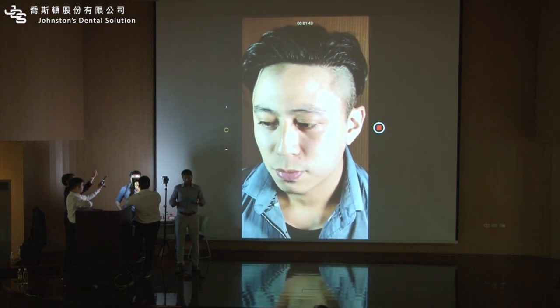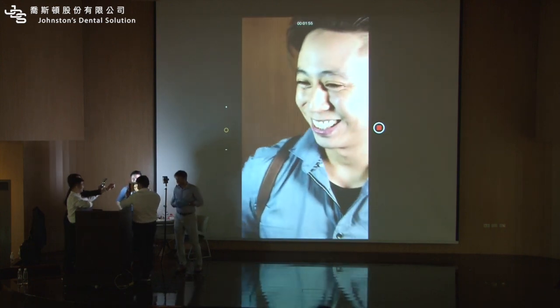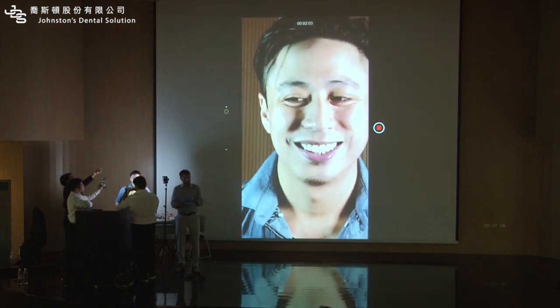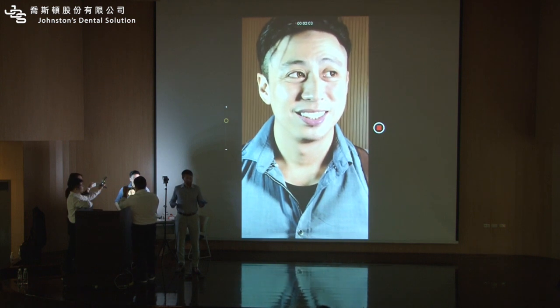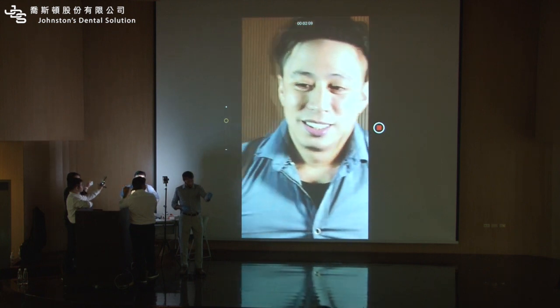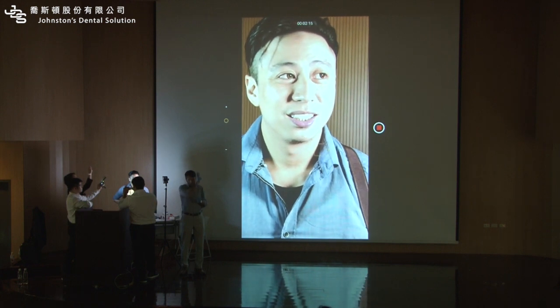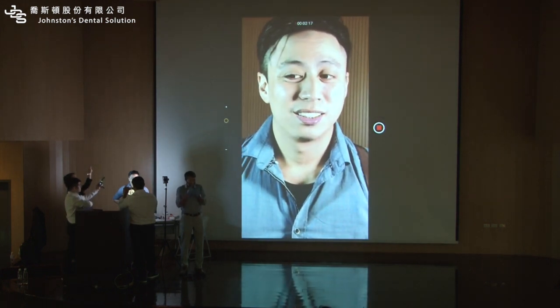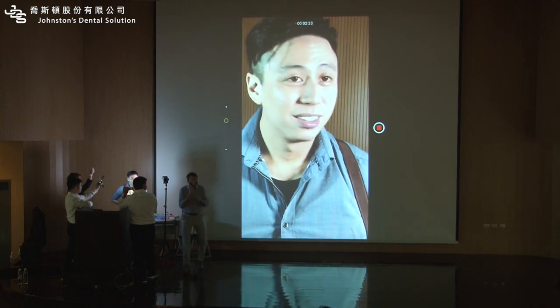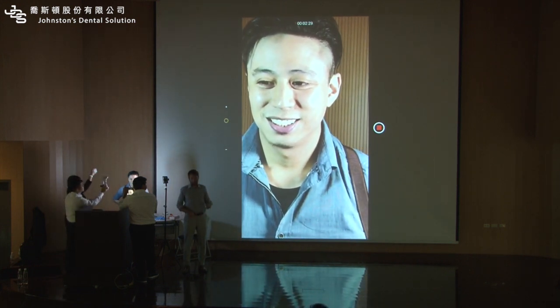So two things you need to understand. Don't worry about what they say now, and don't give them the mirror. If you give them the mirror first, you destroy the whole moment. Okay? Because when you grab the mirror, what happens? You activate your rational side of the brain. You deactivate the emotional side of the brain. And you bring the mirror and you're going to analyze your mock-up rationally. You're going to do like this, you're going to do like that. You will never get those reactions, the nice reactions I show.